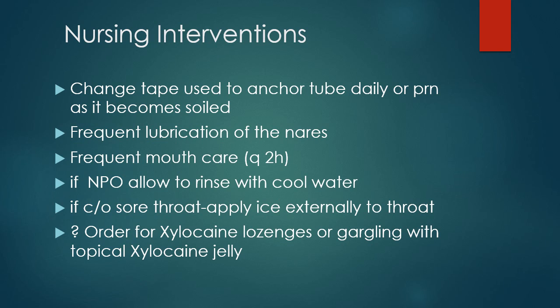We need to frequently lubricate the nares. You need to provide frequent mouth care every 2 hours. And if the patient is NPO, we should allow them to rinse their mouth with cool water. If they complain of a sore throat, you can try ice packs externally to the throat. And sometimes if it's really severe, we can get the doctor to order a xylocaine lozenge or gargle, or even some gel to put at the back of the throat.